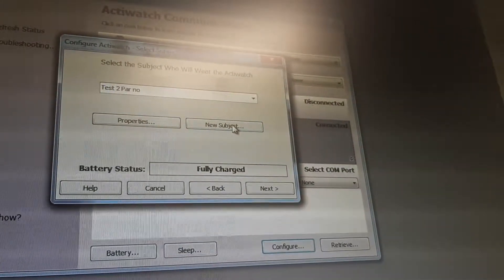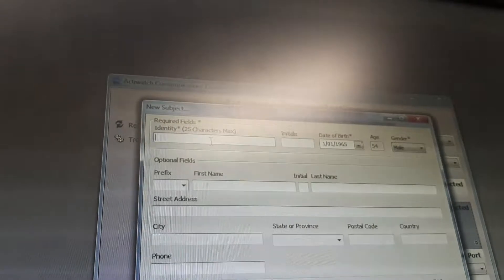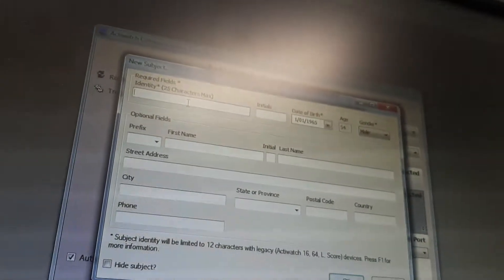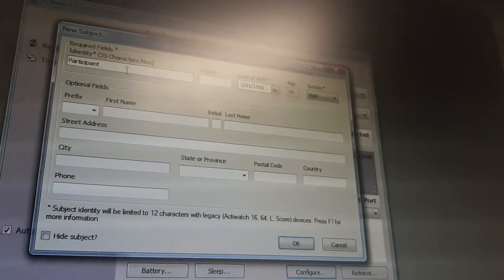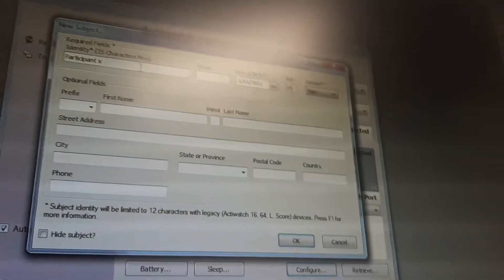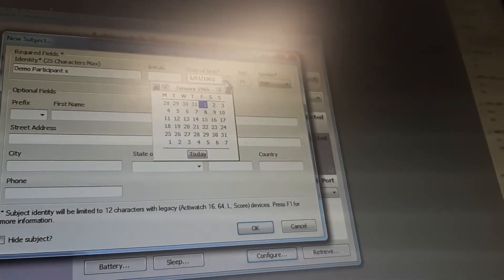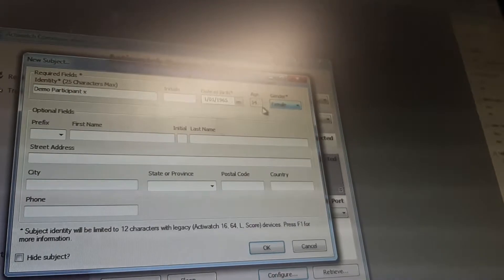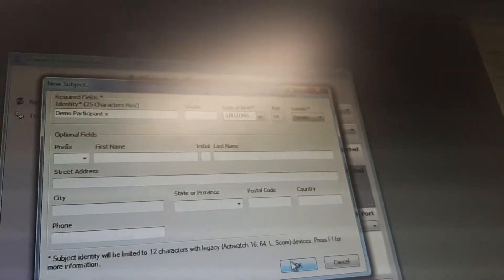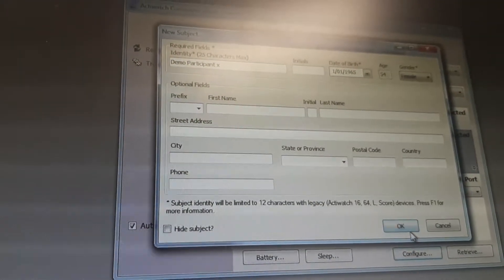I need to click 'New Subject'. For the identity I am using a participant name — 'Demo Participant X', since this is just a demo. I'm not entering any personal data fields. If the participant is female, I would select female. I'm clicking OK because I don't need to collect all those private details, then clicking OK again.